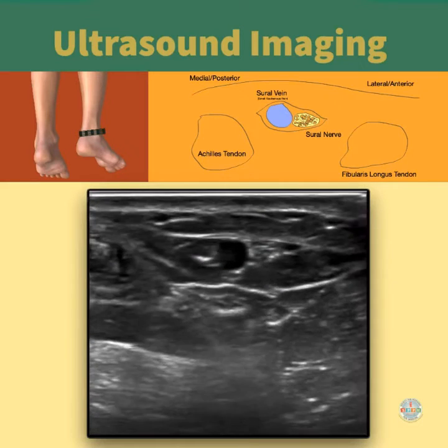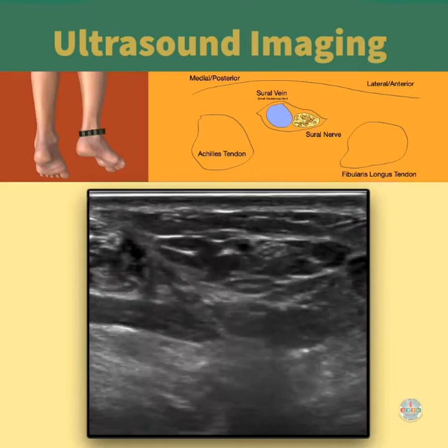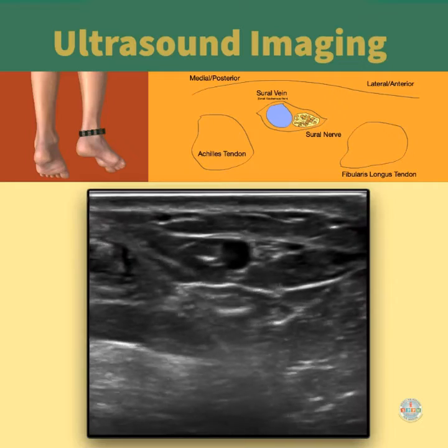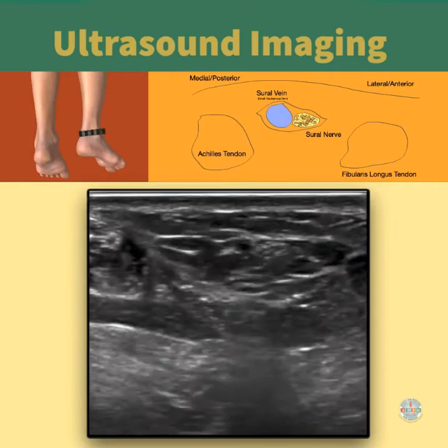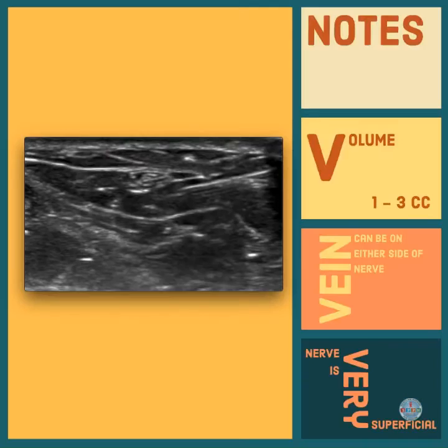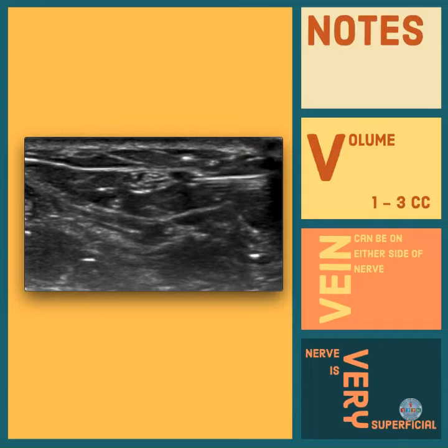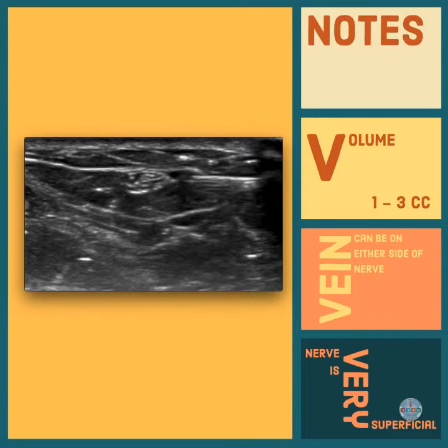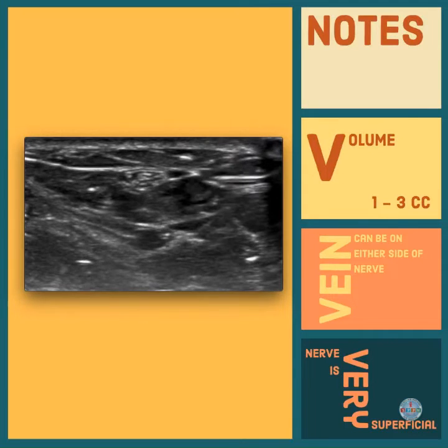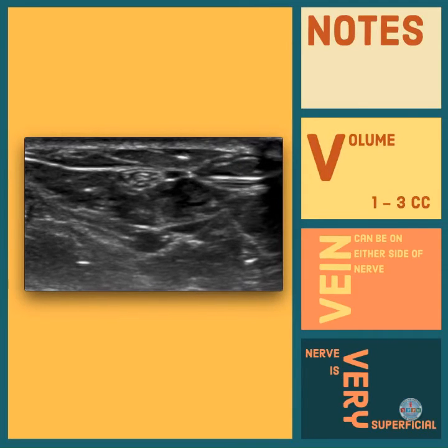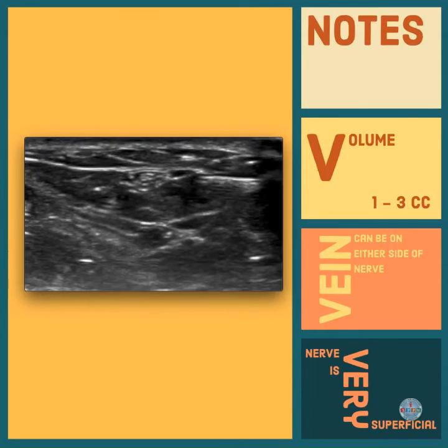Vary your pressure with the ultrasound to identify vascular structures. Note, the volume of local anesthetic is only 1 to 3 cc's. The vein can be on either side of the nerve, and the nerve is very superficial.